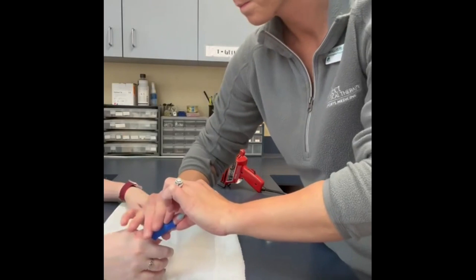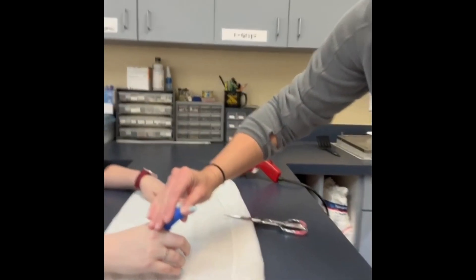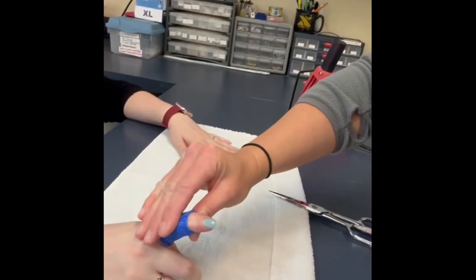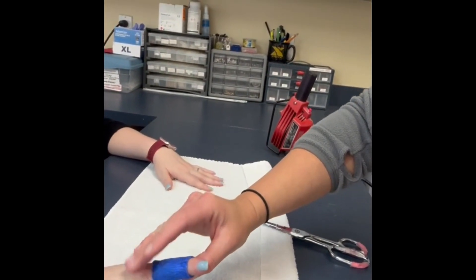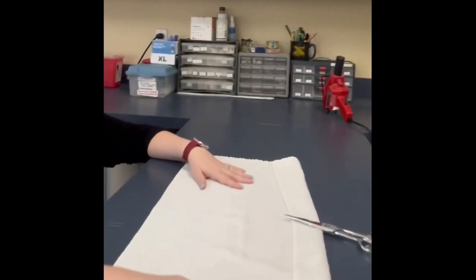Hold the PIPJ in the desired extension position — a low load, tolerable force — and in as much extension as the patient can tolerate. Make sure the patient is able to flex the DIPJ for ORL stretching exercises.